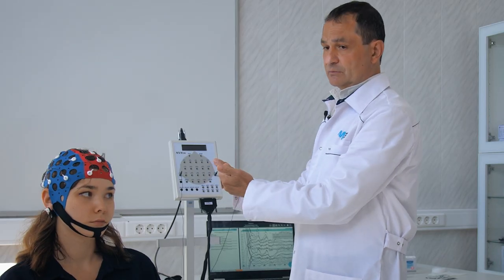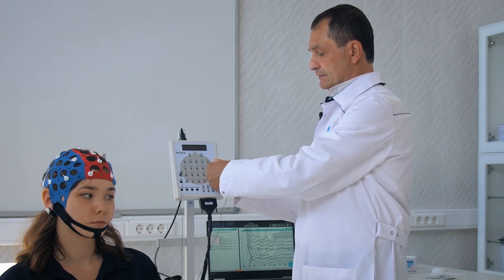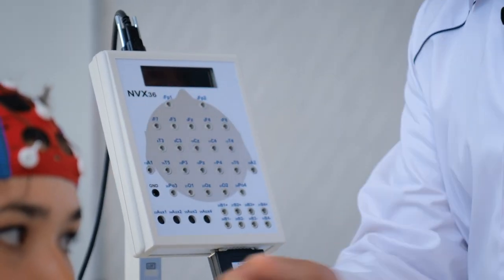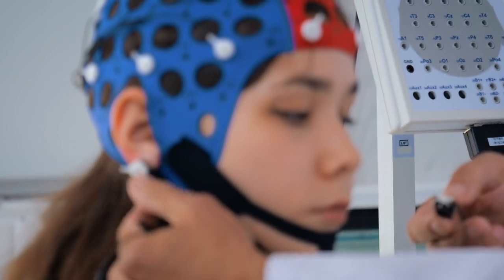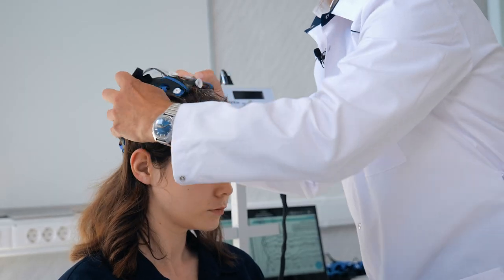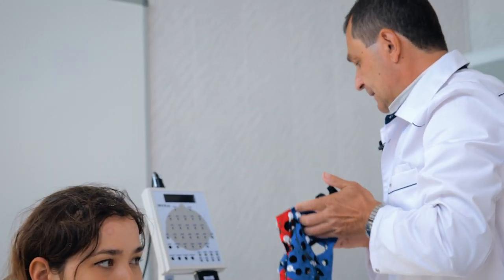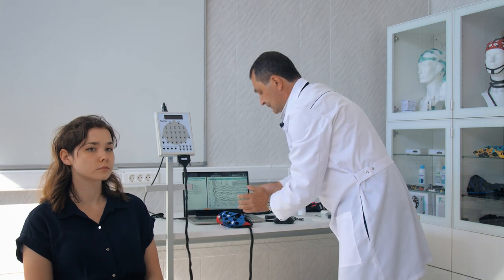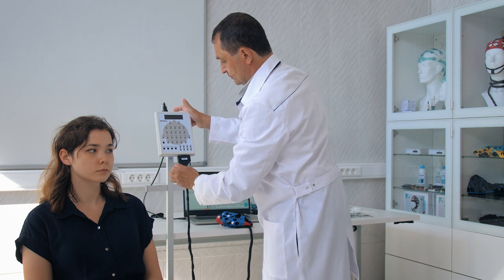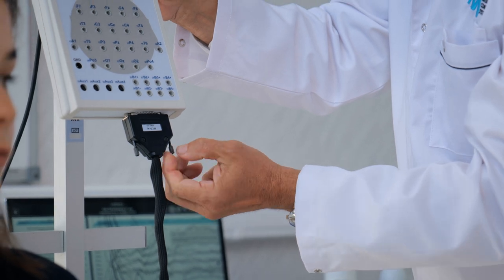We disconnect without pulling the wire and carefully extract the plugs by employing rotary movements in a deliberate and cautious manner. Detach the electrodes from the ears. Next, we proceed to remove the hat from the subject's head. With caution, move carefully in the opposite direction — forward, then backward. Detach the connector from its connection point using the appropriate method.